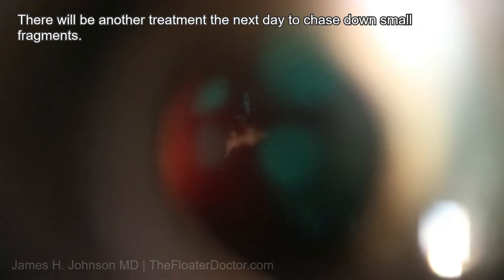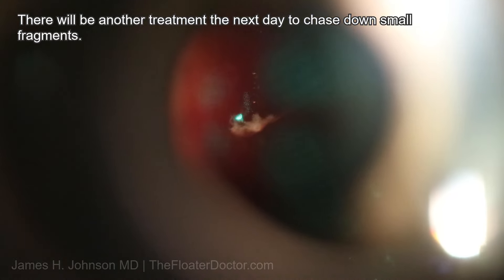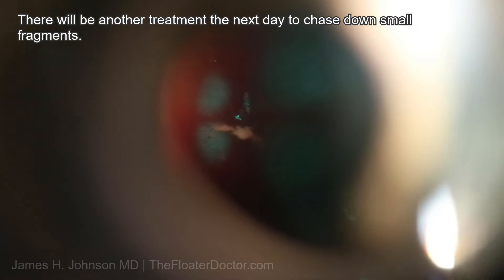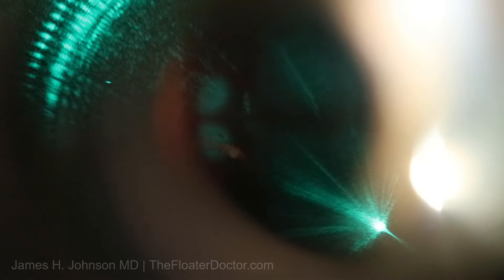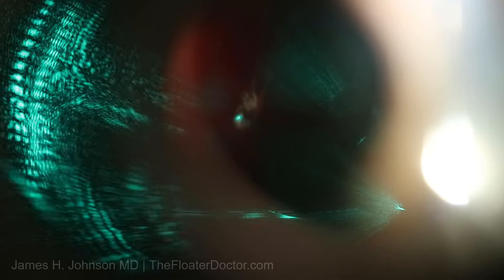I think I was telling him that as his eye adjusts, that will look like debris coming off it. You can see it starting to kind of get shredded, a little moth-eaten, as it starts to break up. What was a tightly formed density is now loosening. This density is about in the middle — anterior-posterior — it's kind of in the middle there, which is a good place to treat. The laser will kind of push that whole complex back, or posterior, a little bit.